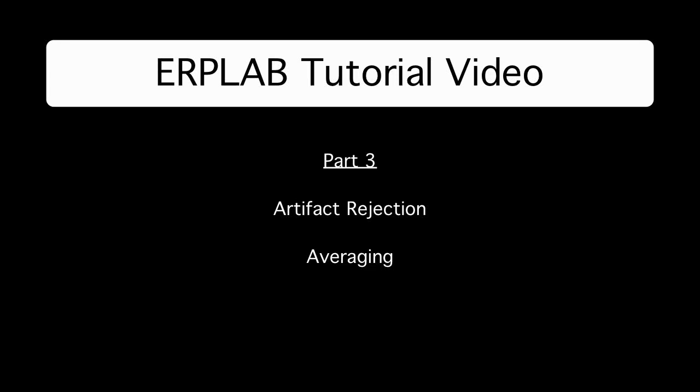Now we're going to move on to artifact detection, and I'm going to explain how to do this using the moving window peak-to-peak amplitude function for detecting artifacts. And this function works particularly well with blinks.